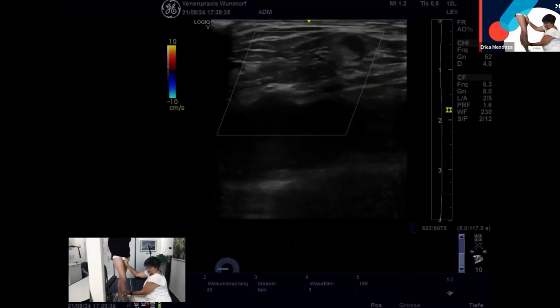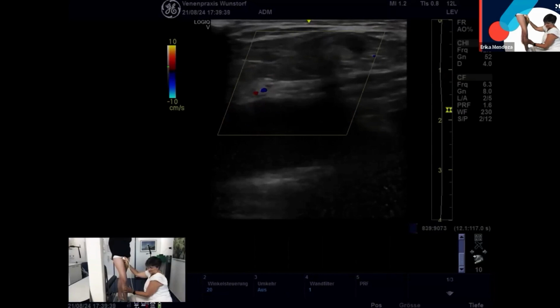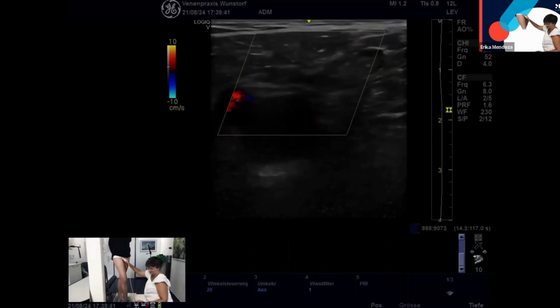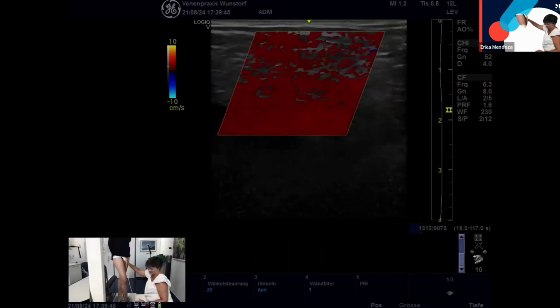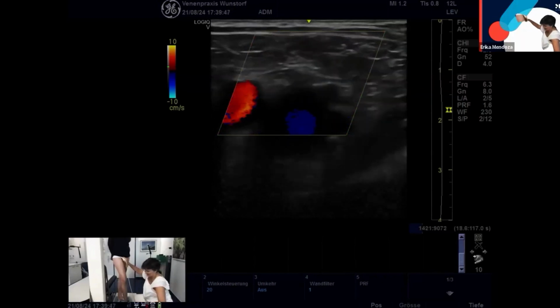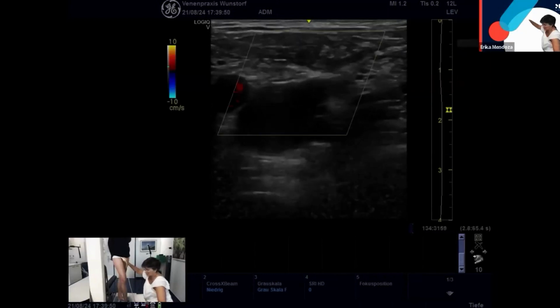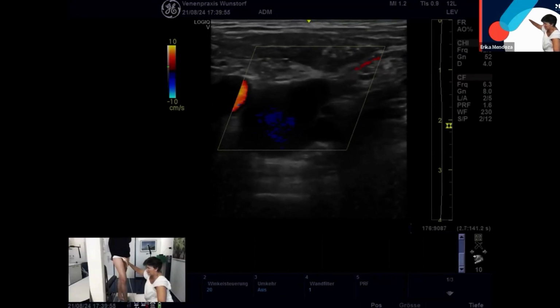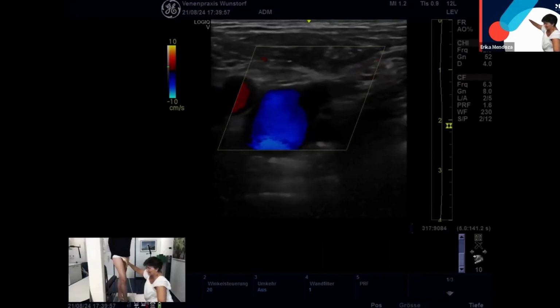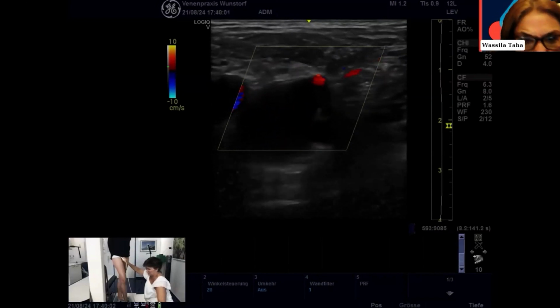So this is the junction place, but the vein is so thin that I can't even make it out. I cannot see the junction yet, Erika. We are waiting. That is the junction, but there is no flow. Perhaps you can do the other side now. Okay, so what I'm doing, I look for it. There is no flow in the junction.